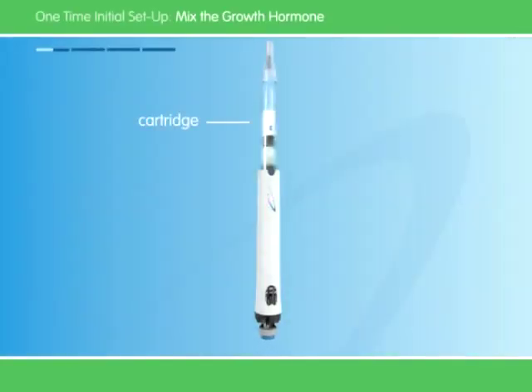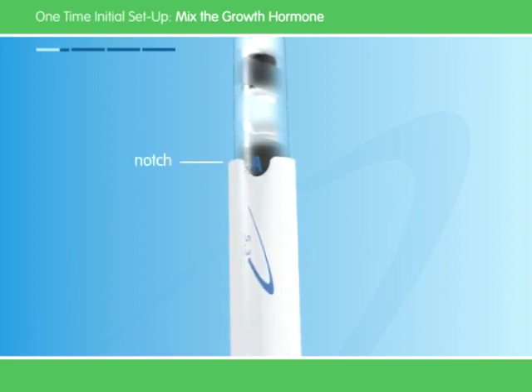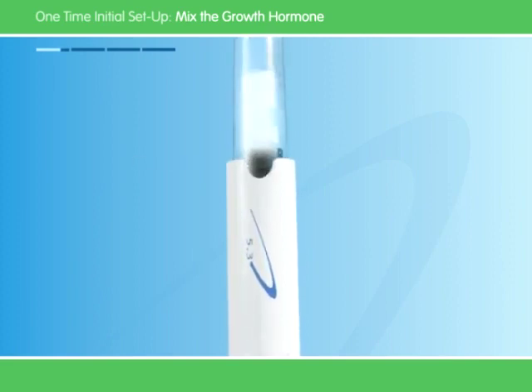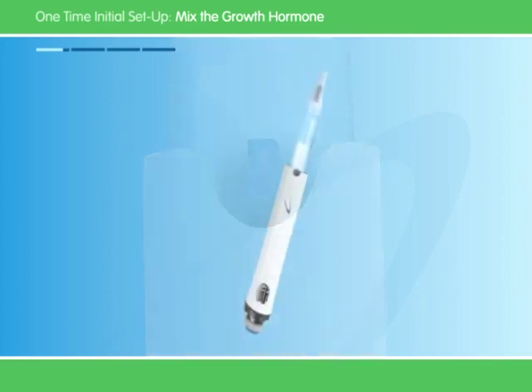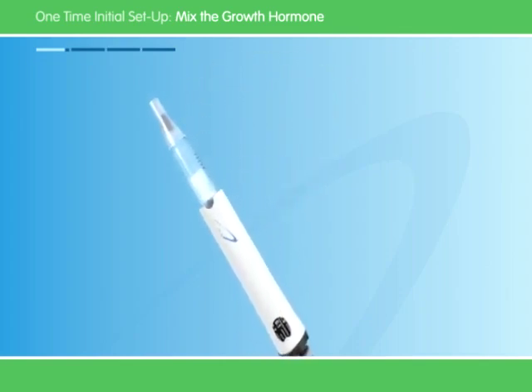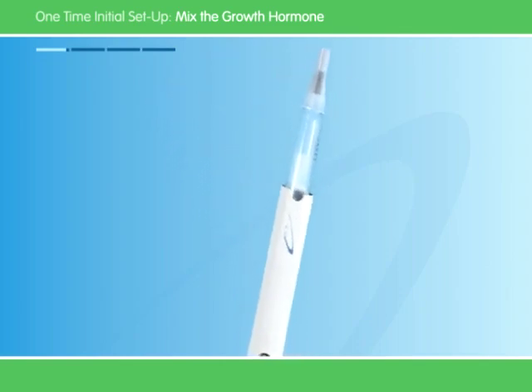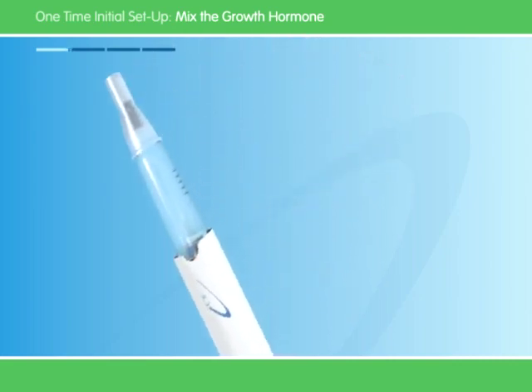The medicine in the cartridge comes in two parts — liquid and powder — which need to be mixed together. To do so, hold the pen with the point up. Make sure to see the letter A in the notch. Twist the top of the pen to the right until the letter B clicks into the notch. Now slowly tilt the pen from side to side. Don't shake the pen because this could damage the medicine. Make sure the medicine is clear. If the medicine is cloudy, tilt the pen again.